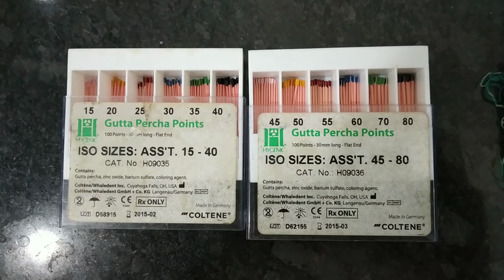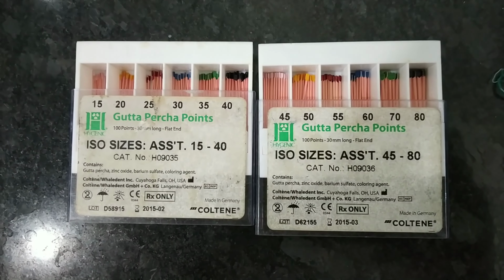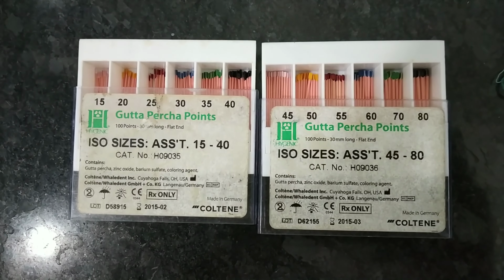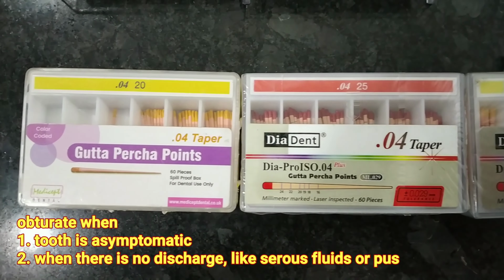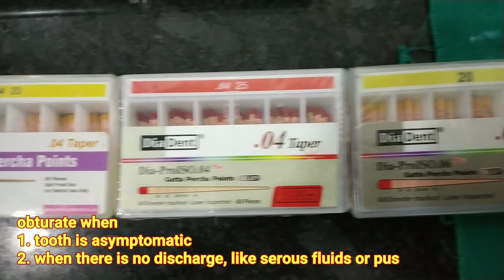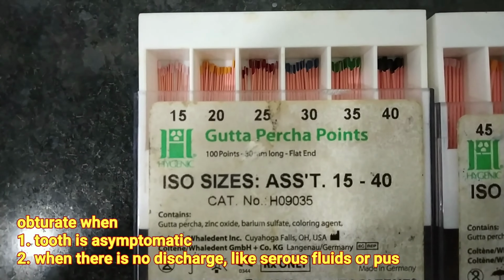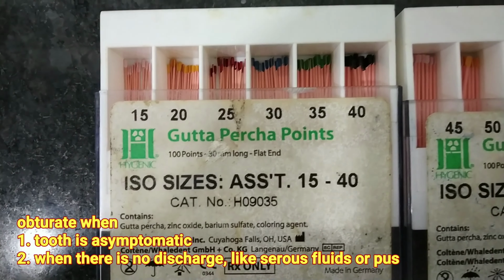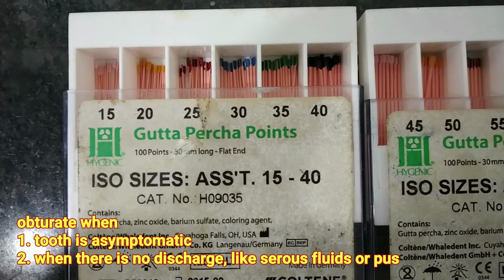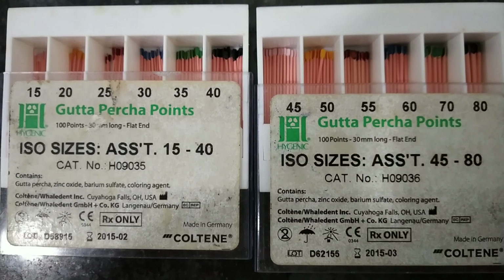But this root canal system is very consuming and time taking. So we have shown in this video about the 4%, 6% files, and corresponding there are the 4% 20, 4% 25 gutta percha as well as the 6% 20 gutta percha. So here you can see the color coding. The white is for 15, yellow gutta percha is 20 numbers, 25 number is simultaneously all the color coding which I have shown you earlier for the files. It is same as of the gutta percha.